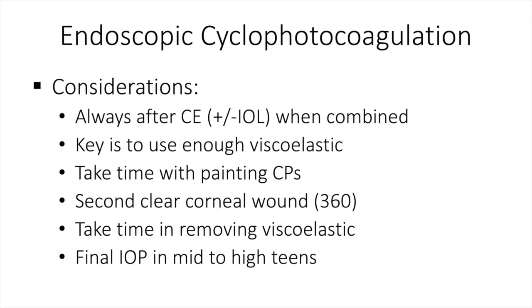Some important considerations with ECP: always perform ECP after cataract surgery, not before — it's quite difficult to do ECP in a phakic patient, and impossible to reach all of the epithelium on the ciliary processes. Use enough viscoelastic to elevate the iris off the ciliary processes so you have a good view and no risk of the iris falling in front of the probe. Take your time painting the ciliary processes. Create a second clear corneal incision supranasally to treat 360 degrees. Take your time removing the viscoelastic to avoid postoperative spikes. The final IOP is typically in the mid to high teens, reached two to eight weeks after treatment.